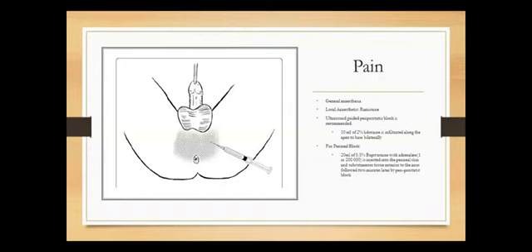So with regard to pain, we can go the general anesthetic route, especially for the transperineal, and also we can go local anesthetic with lignocaine gel. We can do ultrasound guided peri-prostatic block, which is recommended. We give 10 mLs of 2% lignocaine infiltrated along the apex to the base bilaterally, or we can do a perineal block plus a peri-prostatic block. It offers superior anesthetic properties compared to either one alone.